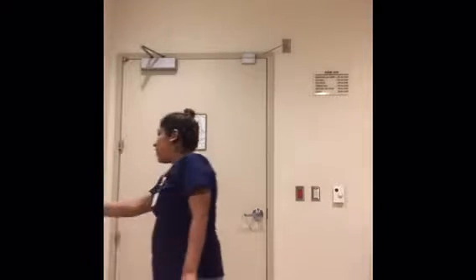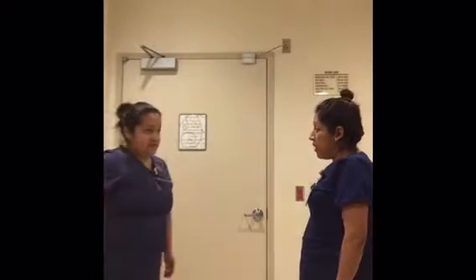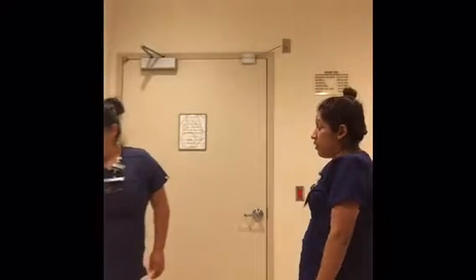Yes. Hello. Hi. My name's Denise. I'm from the radiology department, and I'm going to be taking some x-rays of your skull. Okay. So may I have your first and last name? It's Sylvia Salazar. And your date of birth? 10/27/84. Awesome. And is there any possibility of being pregnant? No. Okay. And what brings you in today? I was playing basketball and I got hit in the head with an elbow. Oh, I'm sorry. Okay, perfect.